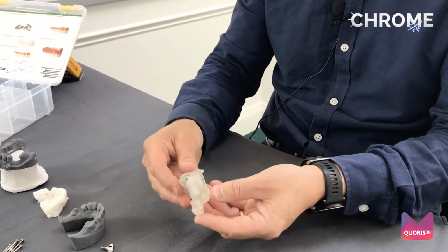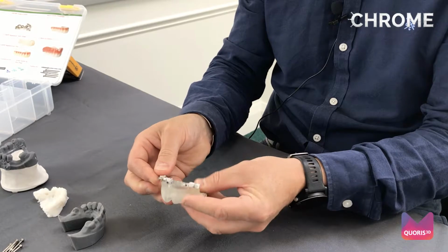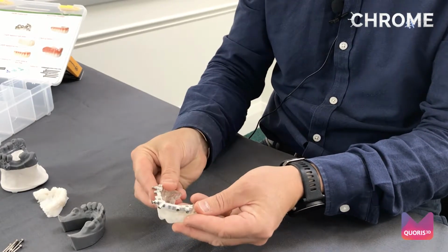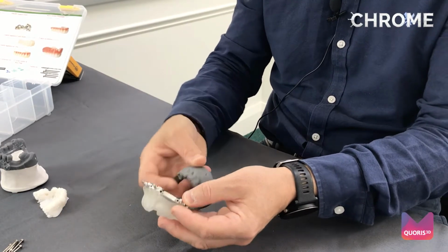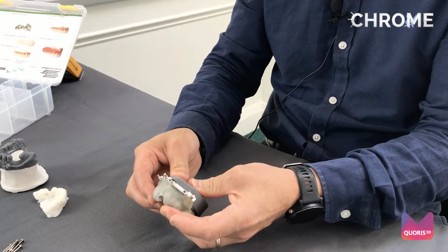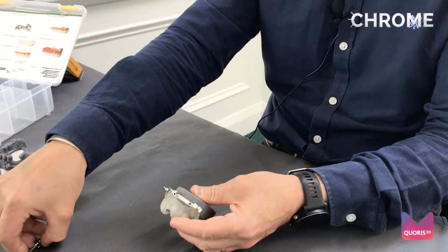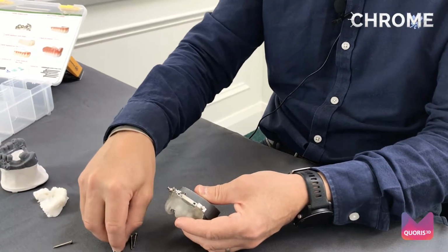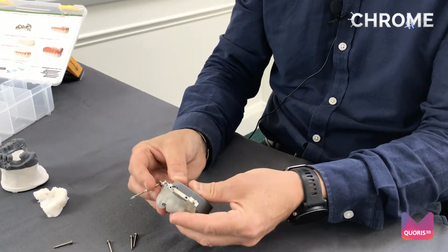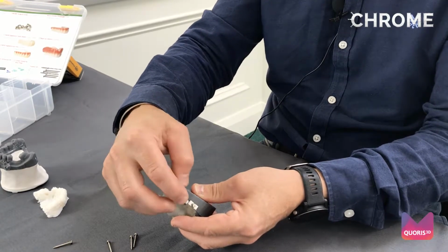you remove it from the mouth and you place your fixation plate onto the pin guide. This simply slots into place and you click the 3 Swiss locks. This is then replaced into the patient's mouth. Again, make sure that everything is fully seated. And then what happens is you take your fixation pins and your twist drill. So if you remember, it's 4 short pins and you drill your slot to the depth that is required.